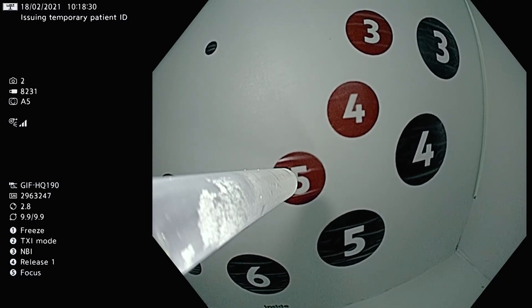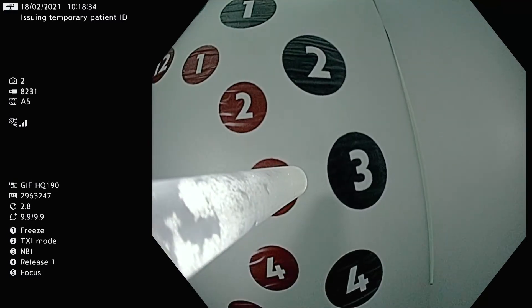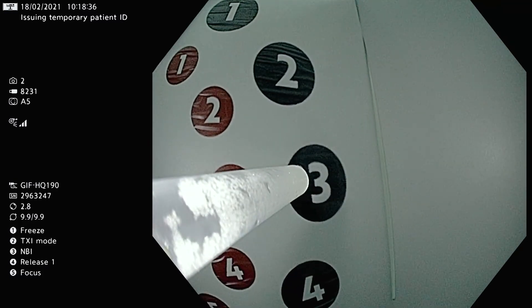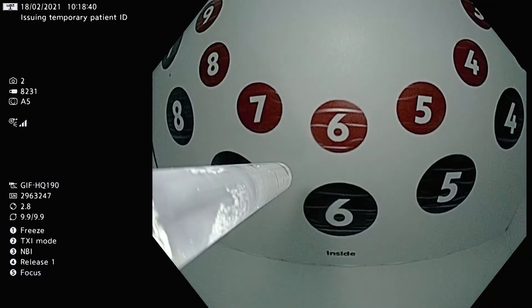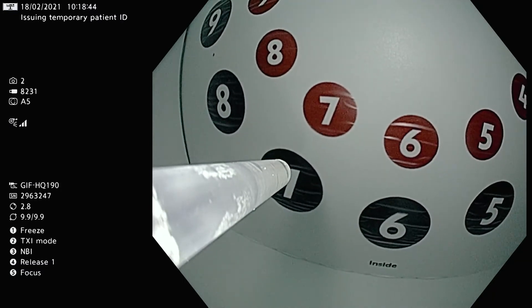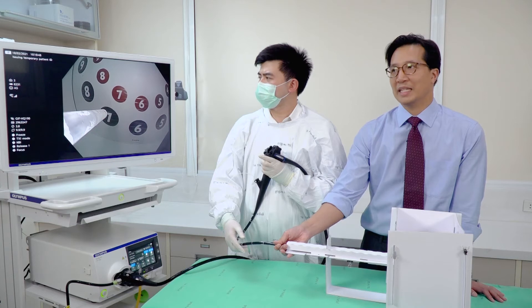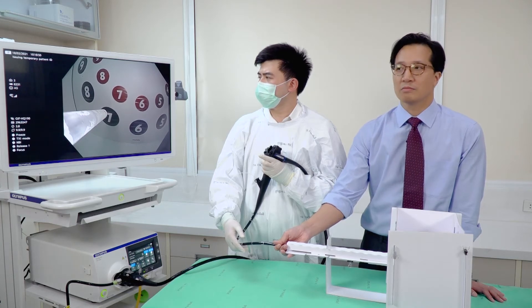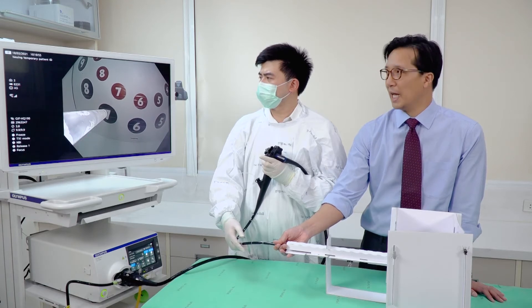The red spots are easier to point to. To make it more difficult, you point to the black spots — for example, three black or seven black. You can also do a whole row of numbers and time your trainee to see how confident or how quick they are at moving the scope with the left hand.